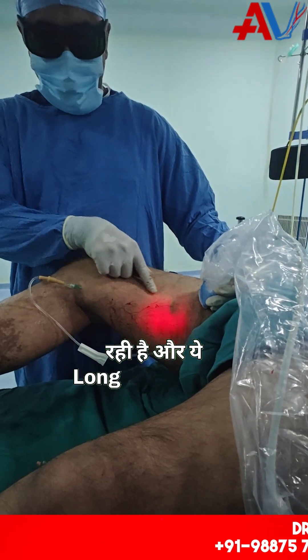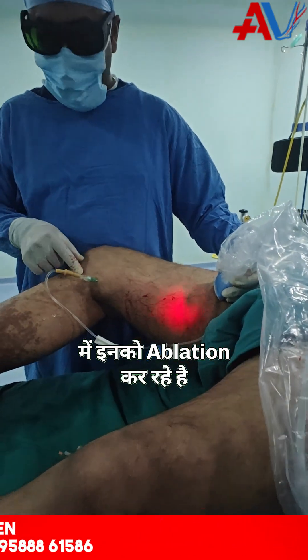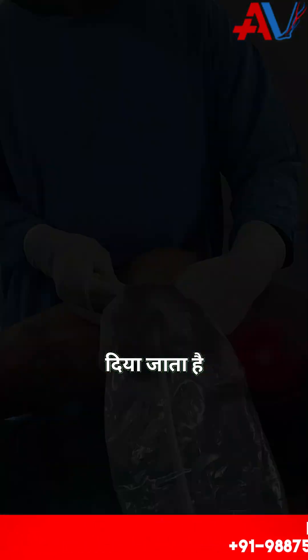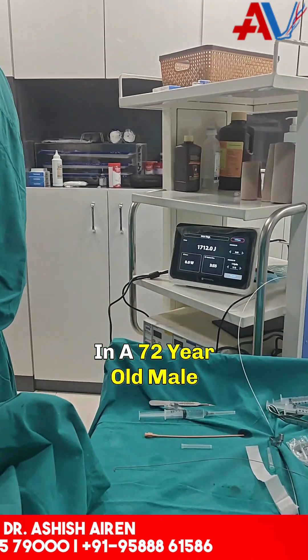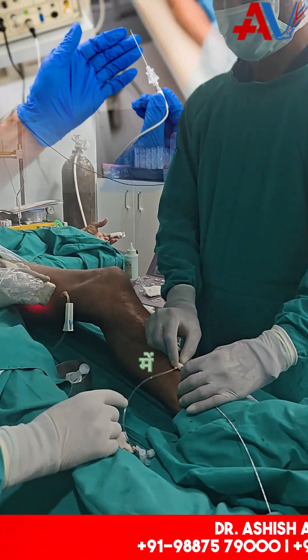This is the long saphenous vein. This is tumescent anesthesia. This is a varicose vein ablation in a 72-year-old male. This is complete local anesthesia.